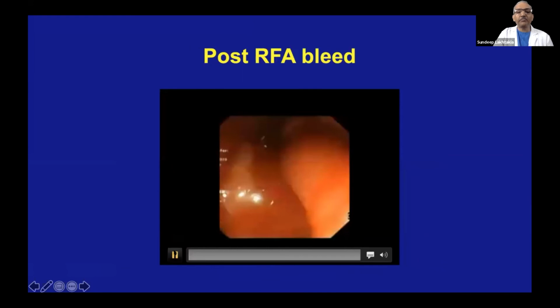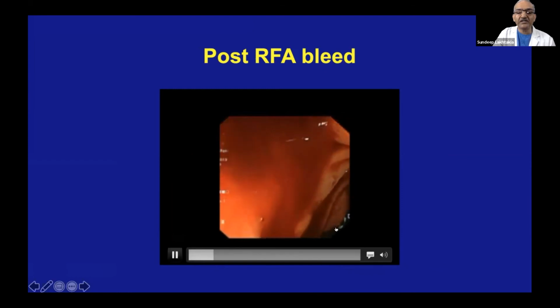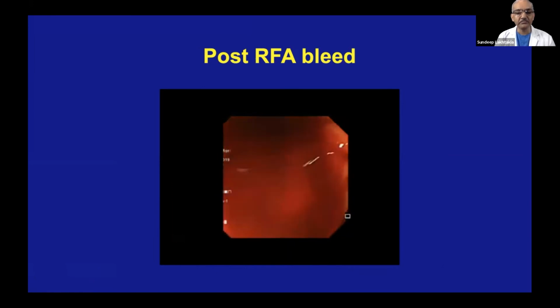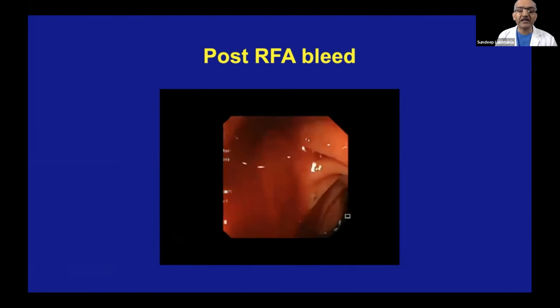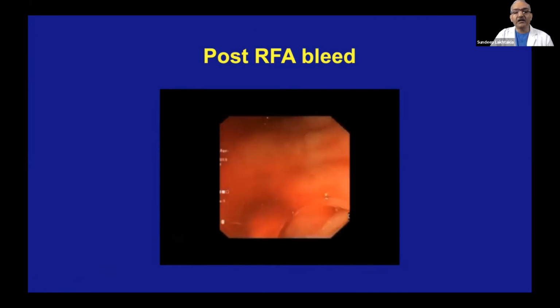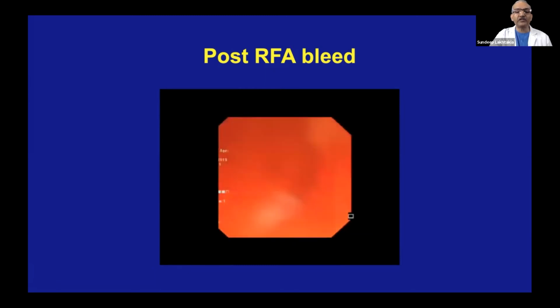And this is a patient who had a significant vascularity in the lesion, and you can see the bleed happening. Also has a stent, you can see deep down. And this is the bleeding which we see at the end of the procedure. This was a patient of RCC actually, which had renal cell cancer, which was operated, but many years later had developed a metastasis to the pancreas, and we had burned that. RCC is a quite vascular lesion, but we kept observing and washing, and in the end, about 3-4 minutes later, we could see there was no further bleeding. So that made us a little more relaxed, and then we could complete the procedure.